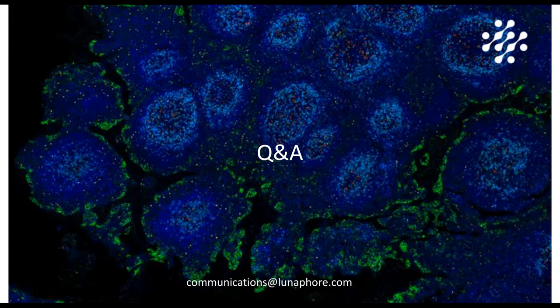And Alexandre, what is the advantage then over Leica's multi-staining Bond RX? Yeah, so of course, I don't think you could directly compare those two devices, because Leica Bond RX is a 30-slide stainer. Here we are talking about LabSat Research, which is a single slide stainer.